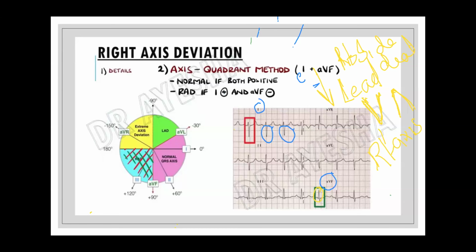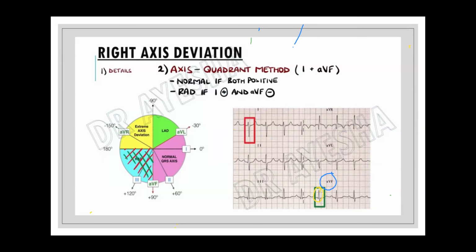Okay. So whichever is easy for you. Some people think this thumb method is easy. Some people think making this circle is easy. Whatever, because in the exam you should have alternative strategies. Why? Because sometimes even the common things go out of your mind, and you become confused in the common things. So you should have a way to figure out that problem.